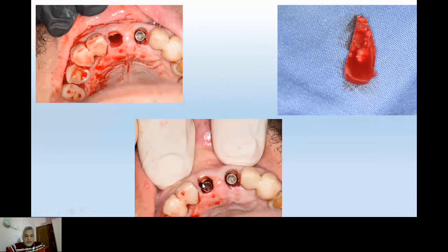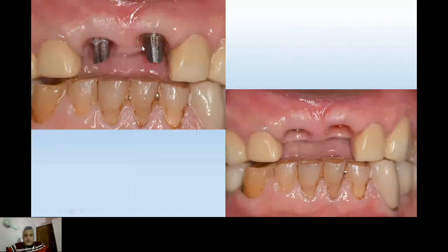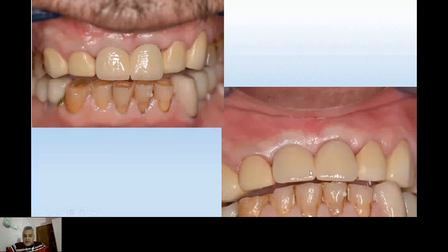It's better to leave a space between the implant and the buccal shield, and sometimes you can fill it with bone graft, synthetic, or even autogenous that comes from the drilling. This is after 4 months. You can see here small parts of the buccal shield, and this should be removed by trimming. I made a trimming for it, and this is the final insertion. You can see here good gingival contour and good gingival healing, and no depression in the area.